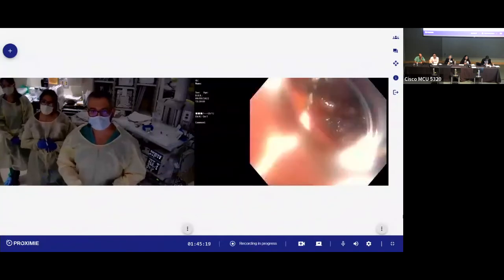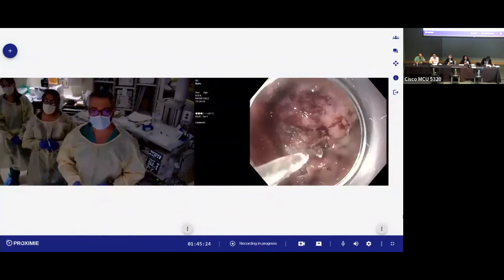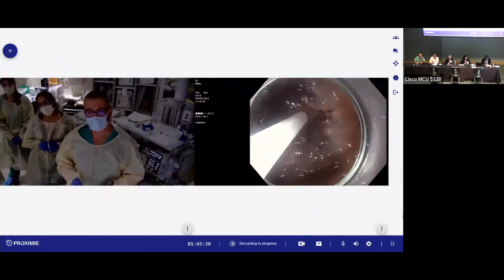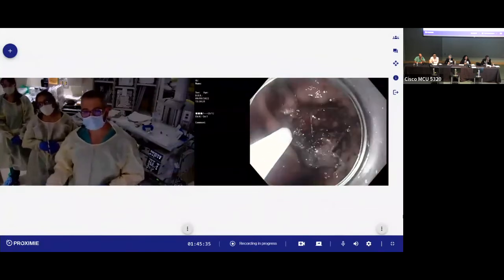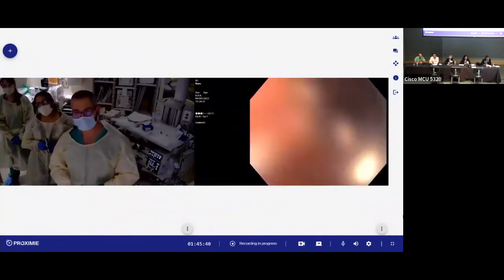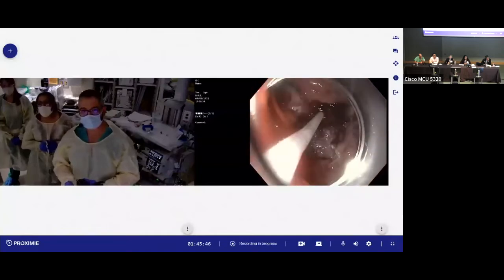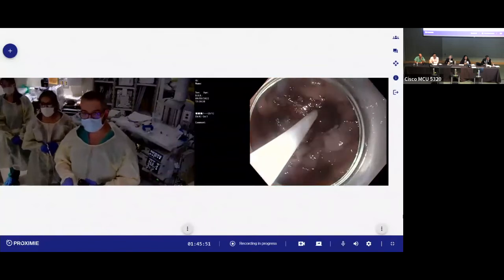Now it is open enough. This is not open all the way to the end, so try it again, close completely. Yeah, you want to open just enough to get the tissue. Let's open the snare. I will hook it there, open a little bit more, and once I get the desired opening, I will tent my scope to suction the tissue here. Then my technician will have to close slowly. Start closing, slowly, slowly. Beautiful, you're doing great. Good job. You're snug now. All right.